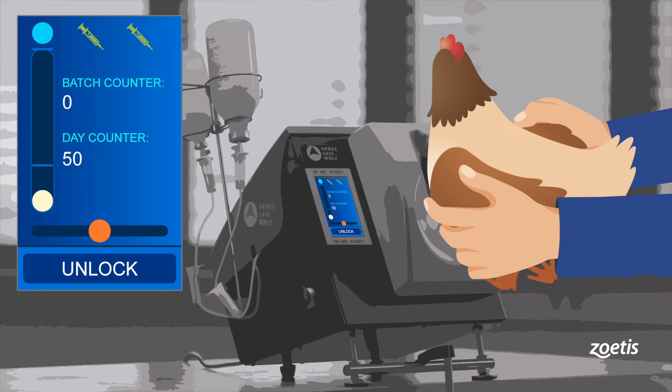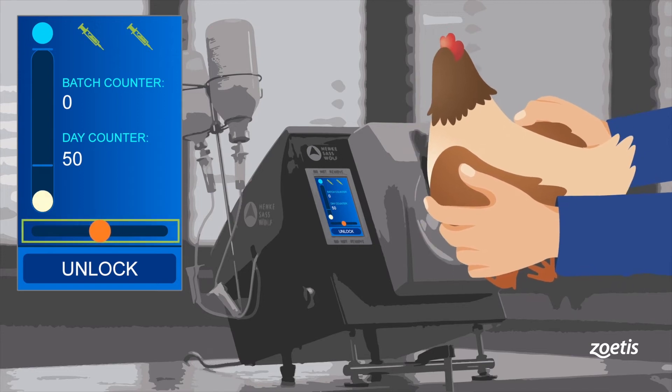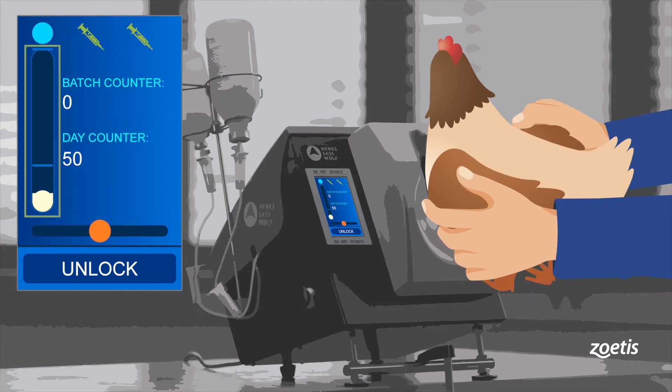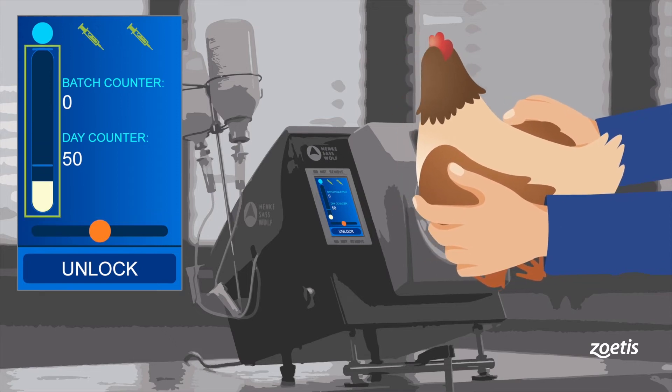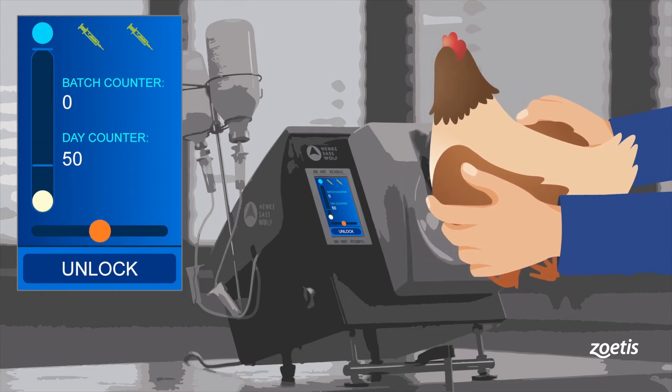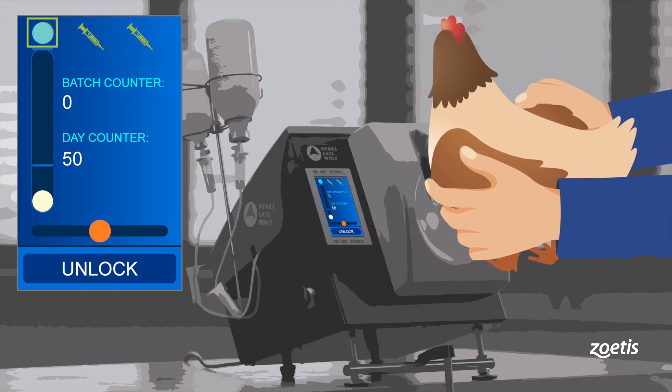Position a chicken on a breastplate with its head up. The mold, in combination with the device sensors and display, will guide you on how to position the chicken properly. There is a sensor for proper left-right positioning, a sensor for proper breastbone position and needed force, and a sensor for correct upright position of the chicken.